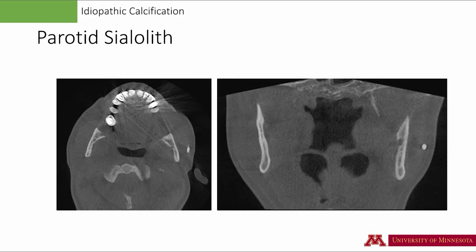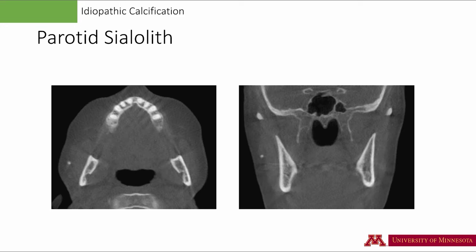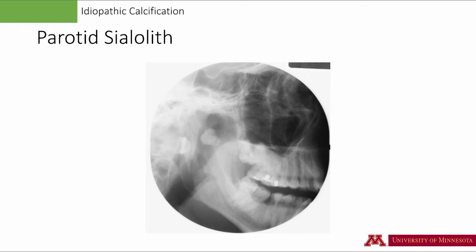Parotid sialoliths are rare. As you would expect, the parotid gland being on the buccal aspect of the mandible, you will also see the sialolith on the buccal aspect of the ramus. Again, the outline is smooth and well-defined with uniform density. Another example of a parotid sialolith, this time on the right side — on a lateral skull or panoramic radiograph, the sialolith may be superimposed over the ramus. Earlier we had seen tonsillar calcifications, which are multiple. A parotid sialolith is usually solitary.